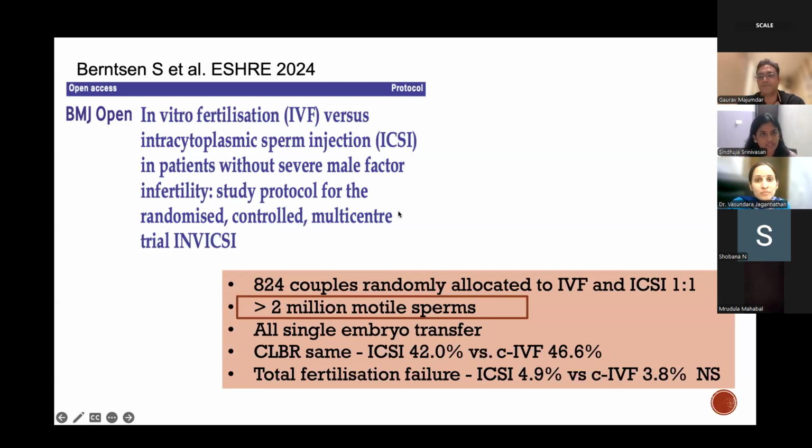So I think I'm going to summarize all your excellent points now. You mentioned well culture and high volume culture, and then 6 to 8 OCCs and around 20 to 30,000 sperms per OCC and overnight, long incubation IVF.